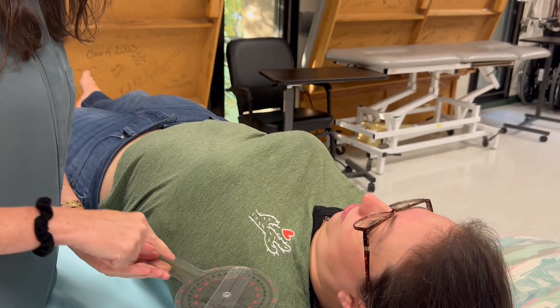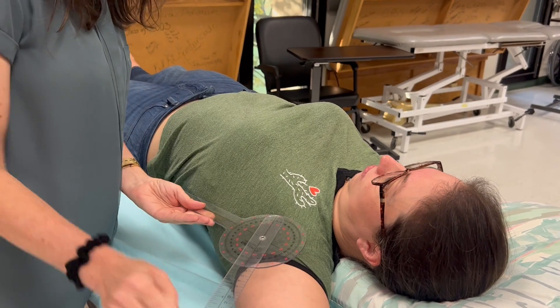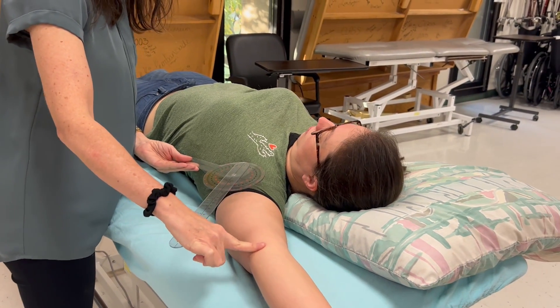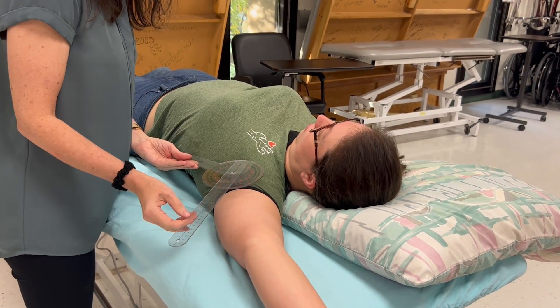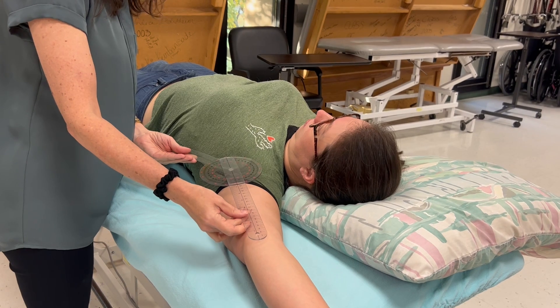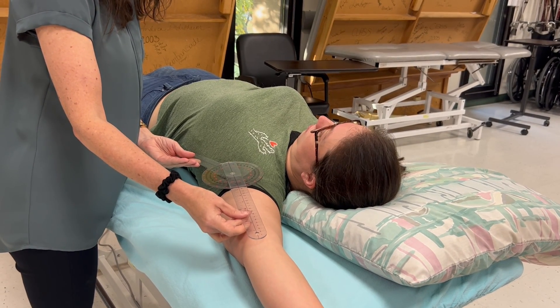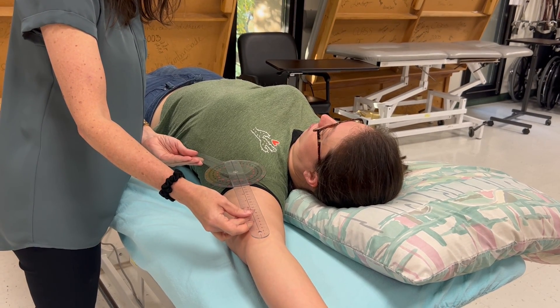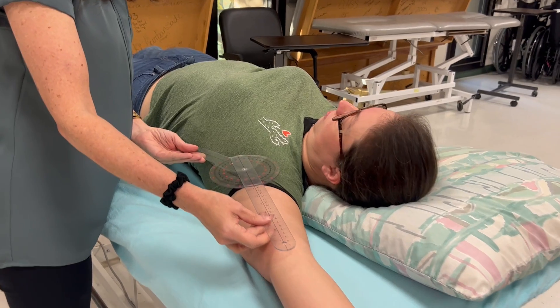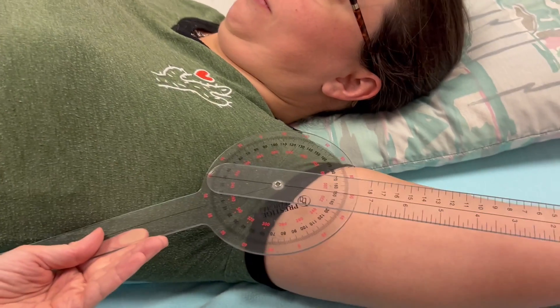The moving arm is going to be lined up with the medial epicondyle of the humerus. I'm getting about 151 to 152 degrees of abduction.